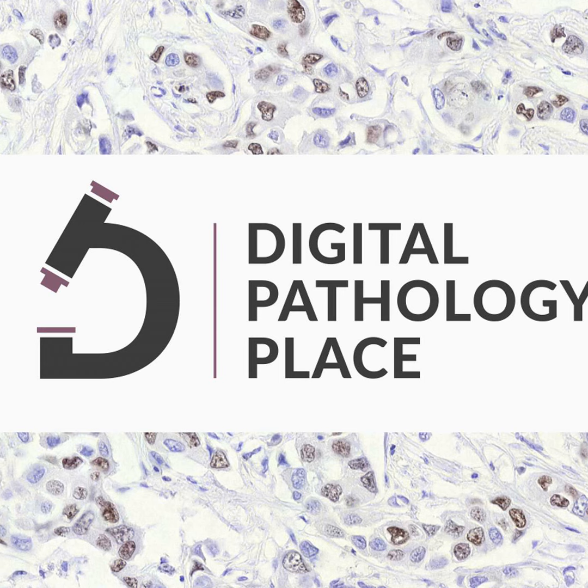And then slowly you learn what is abnormal. So you iteratively get better at identifying the abnormal patches. After a bit of training, you get reasonably good at finding the cancerous patches in cases with cancer. Then you also start leveraging those in your learning process, and you get a better and better understanding of what is cancerous as well.